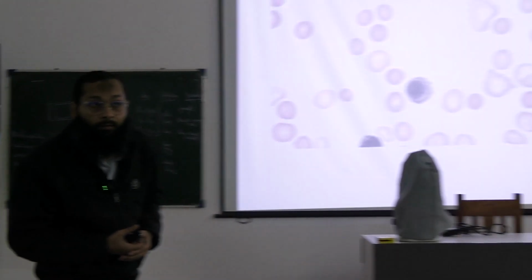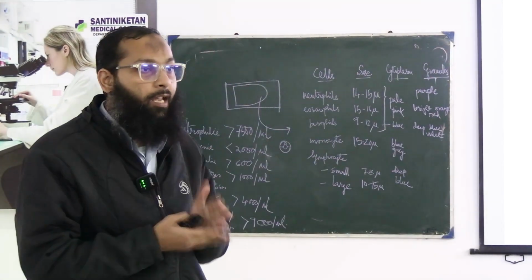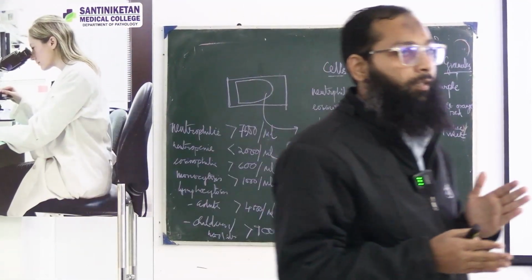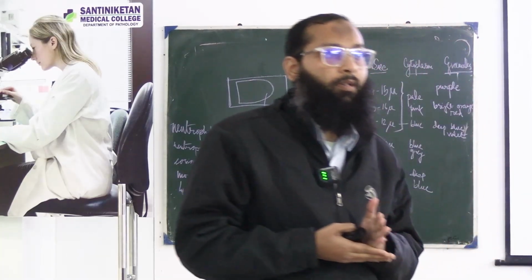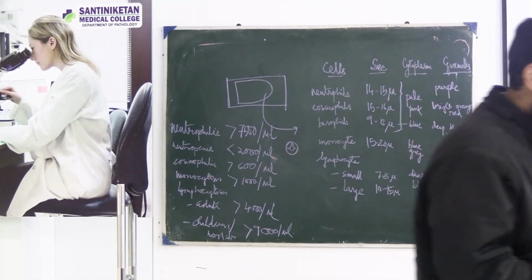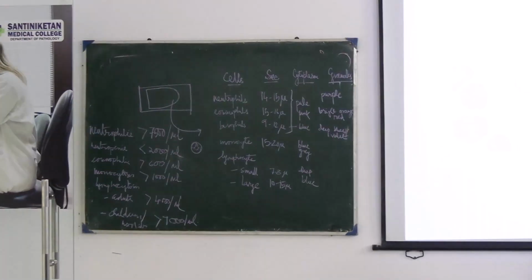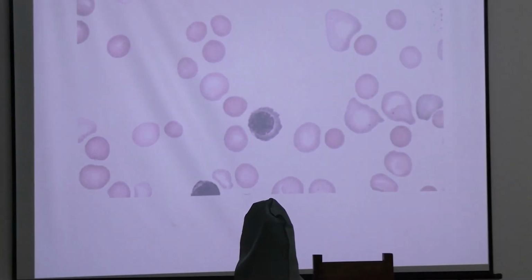Two is the wrong answer. More than 3 is right. At least 3, not nucleus, lobes. The nucleus is one. The 3 lobes are there. Sit down. So, description of a neutrophil, is it clear to all?